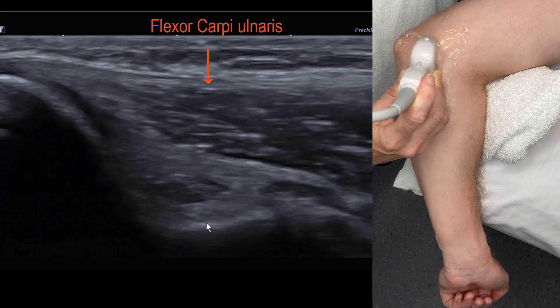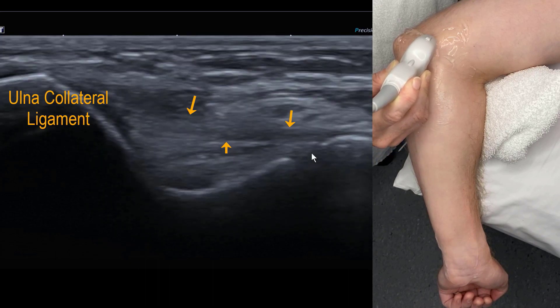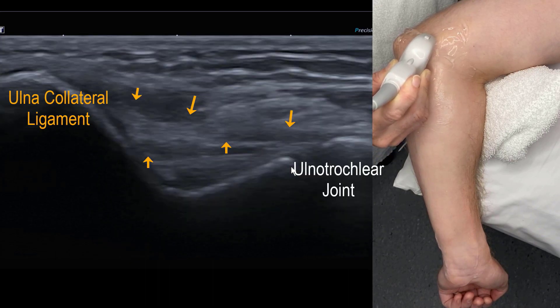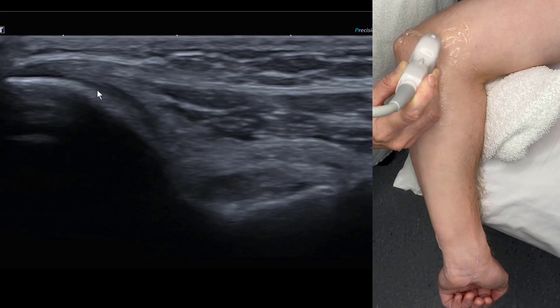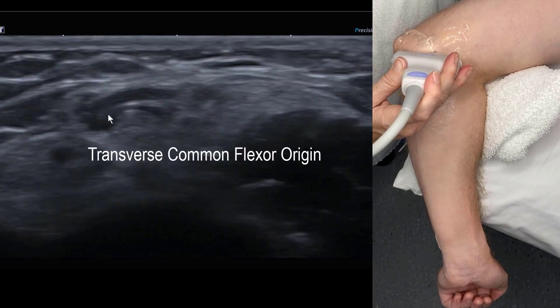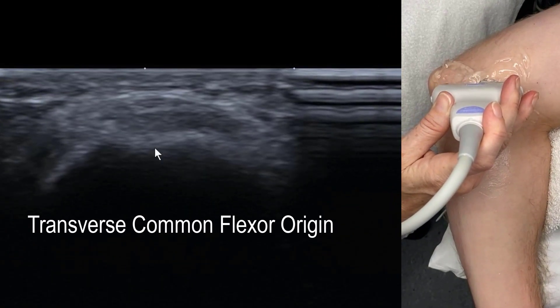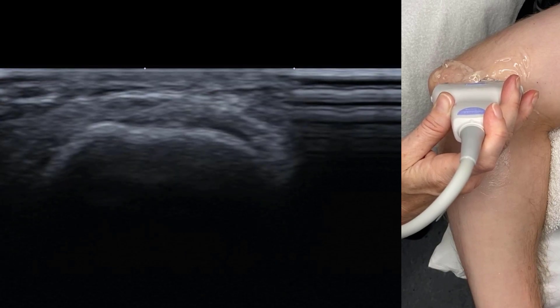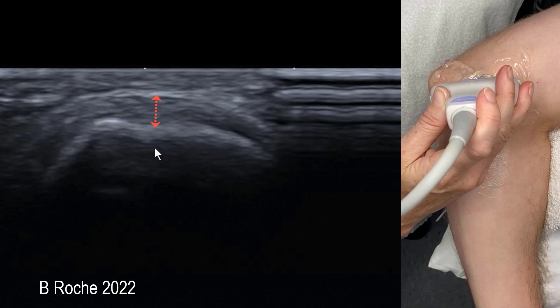Underneath the FCU, if we oblique the probe, we can see the anterior band of the UCL spanning the ulnotrochlear joint. That ligament is the main stabiliser against valgus stress, so there are stress ultrasound tests that can be performed there. As you can see, there's a broad common flexor origin in transverse — it's a conjoint tendon with all fibres blending together, but there's definitely an anterior, a central, and a posterior third to that tendon.